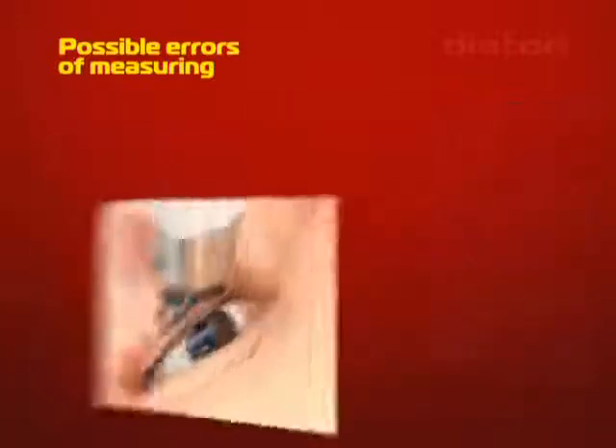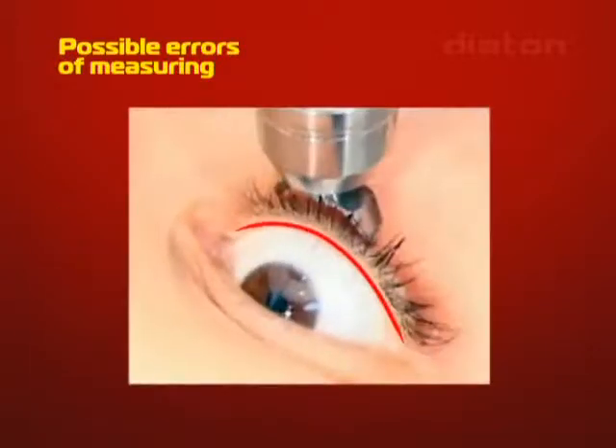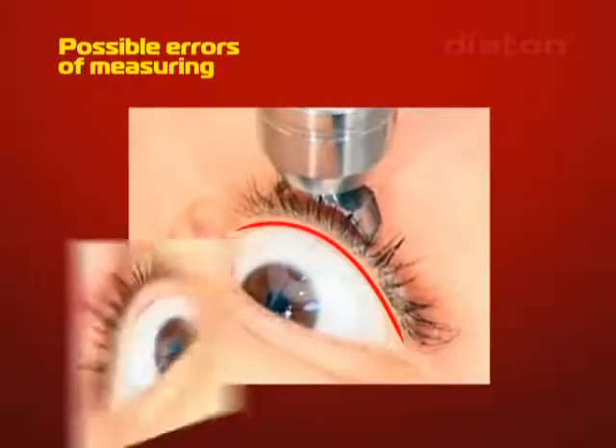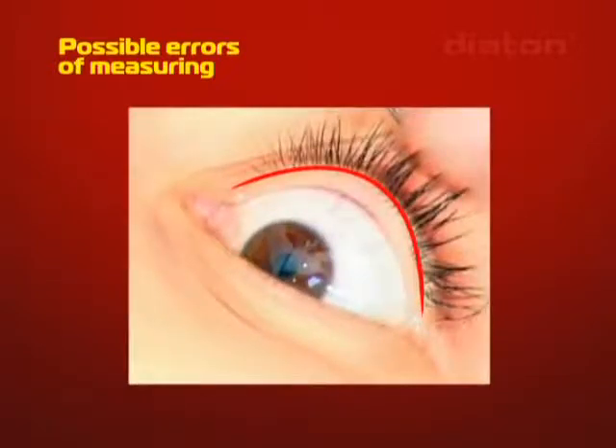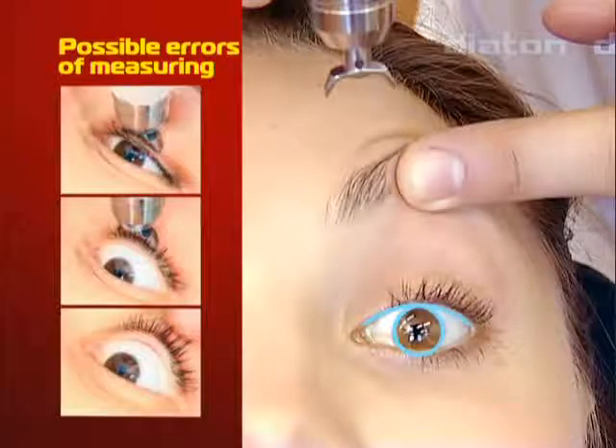Mistake: Incorrect eyelid position during measurement. Possible errors include the edge of the eyelid reaching the cornea during measurement, the edge of the eyelid being above the corneal line, or the eyelid being pulled out while stretching it too strongly. Correct method: Properly fit the upper eyelid so that the limbus edge aligns with the eyelid using your finger at the moment of measurement.